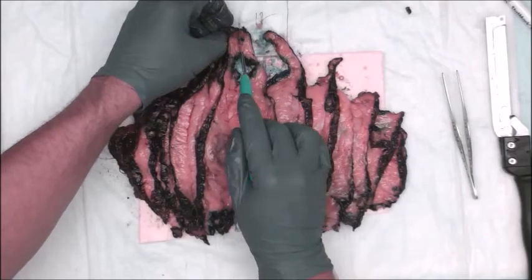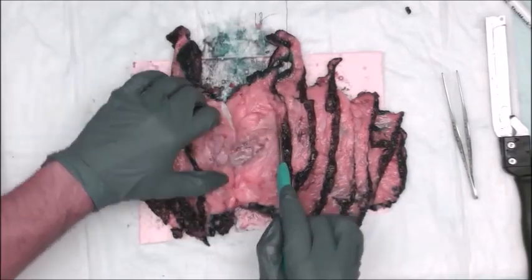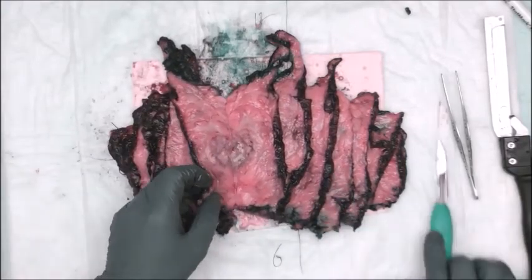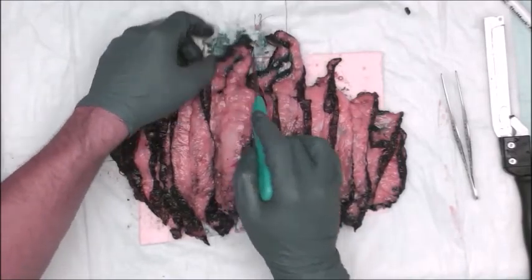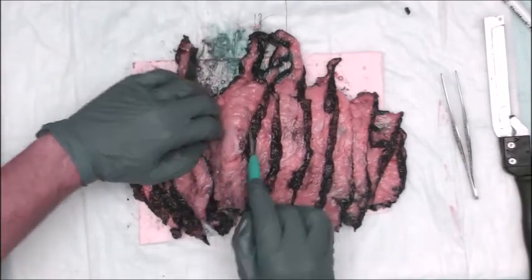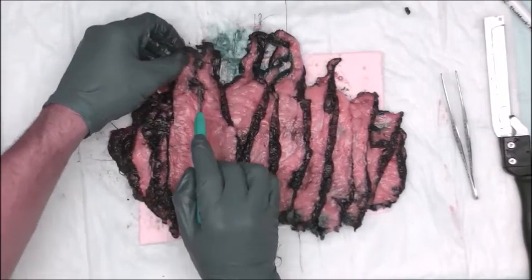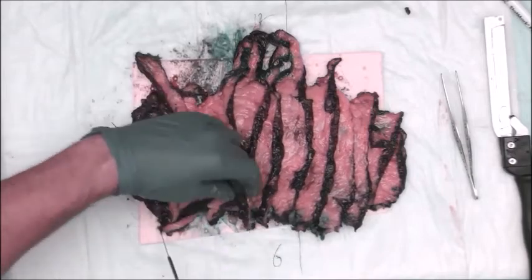We're kind of in that region of the necrotic mass, which is right here, which kind of correlates with the indurated area I mentioned at the beginning of the tutorial. So I'm going to continue my cuts here, make sure I don't miss anything. Okay.